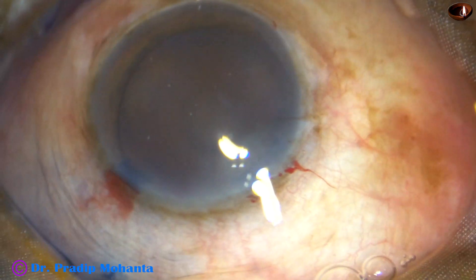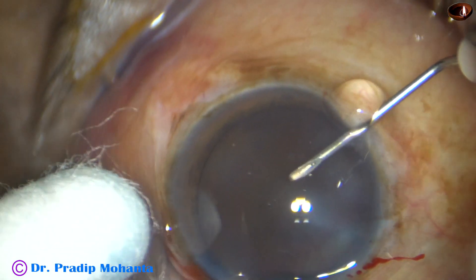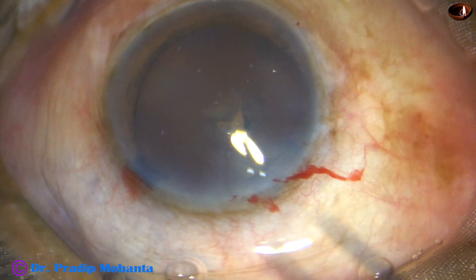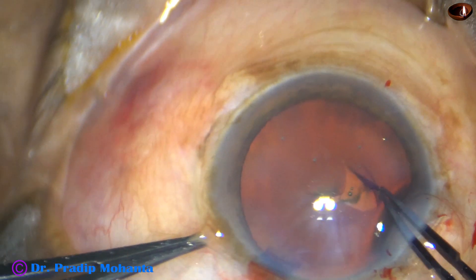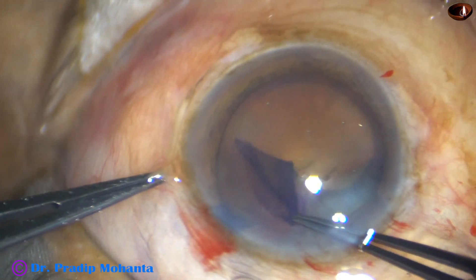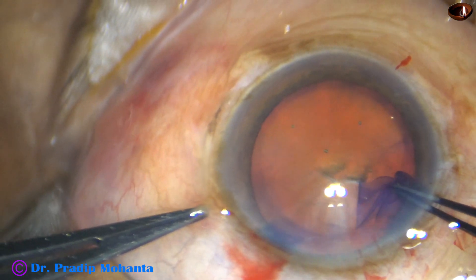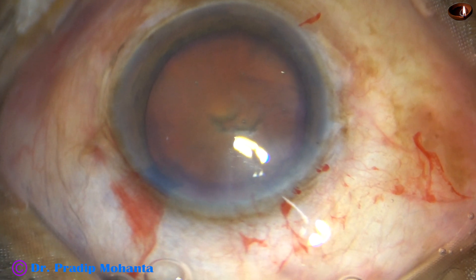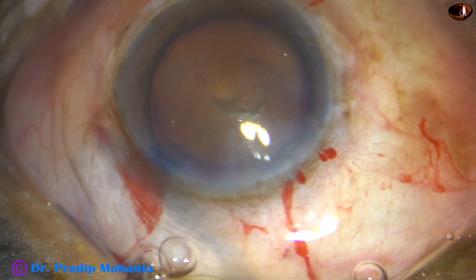And now is the time to do capsulorhexis. In hard cataracts, I always do a rhexis of about 6 mm size. A large rhexis is a necessity in hard cataracts — it should not be less than 5.5 mm and not more than 6 mm. This rhexis of about 6 mm makes nuclear fragment management much easier.